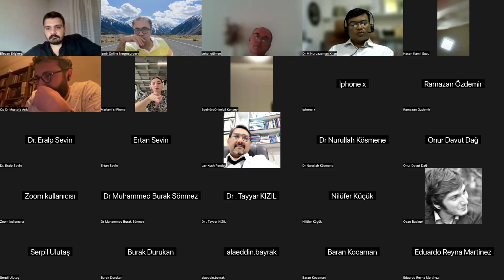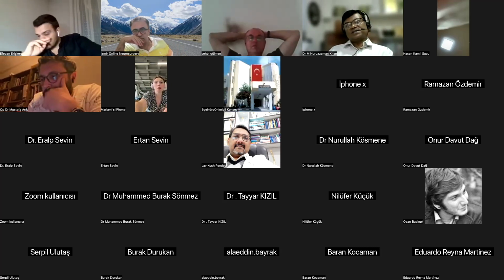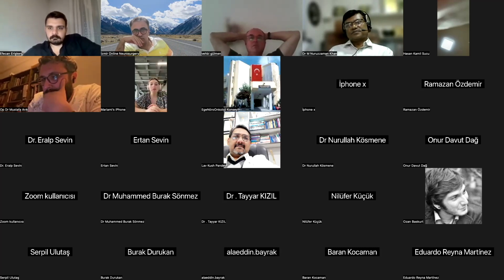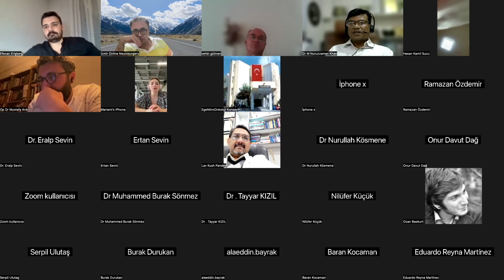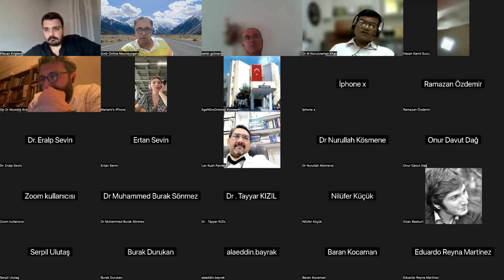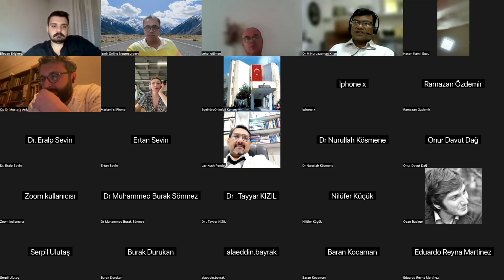But in one of my cases in my early practice, there was a big dural tear, and I converted the surgery to open surgery. So there may be a dural tear, but we have to identify it and take care accordingly. A dural tear may happen from mishandling of the burr as well as the Kerrison punch.